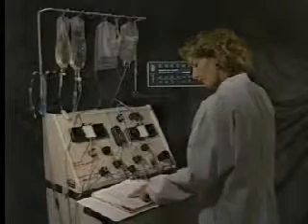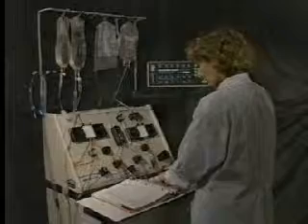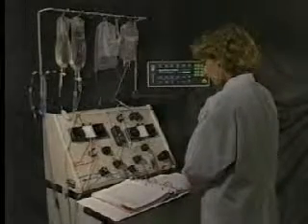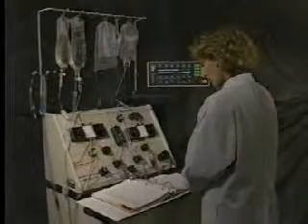To feel confident when troubleshooting, you need to be well acquainted with the troubleshooting section of the operator's manual. This section has a bright red tab to help you locate it quickly. Turn to the table with the heading that reads Spectra Alarms in the Troubleshooting section. Notice that it provides a concise alphabetical listing of the alarm messages exactly as they appear on the control panel, along with the alarm status and valve positions. This table also refers you to pages later in the troubleshooting section that give you more details.